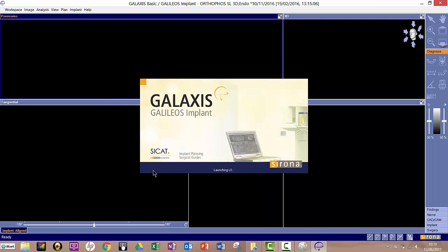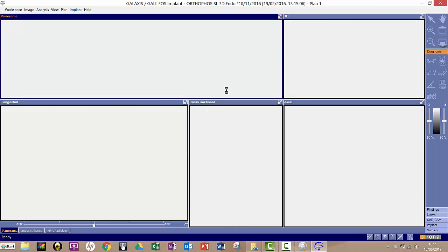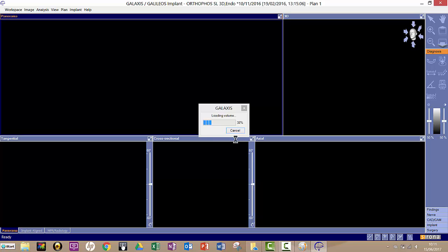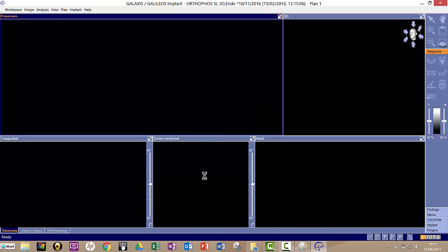And when this loads, you will see familiar CBCT layout. So you see your five windows here. It's loading the volume now.